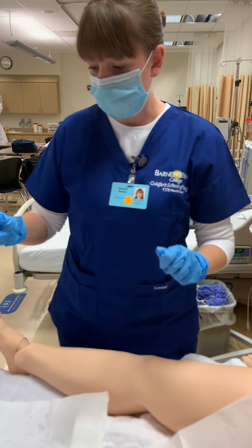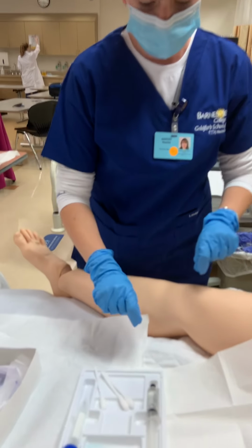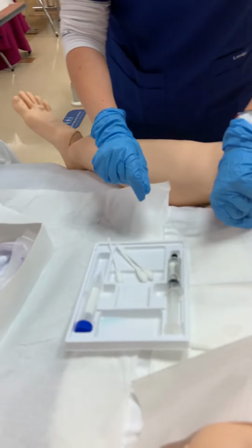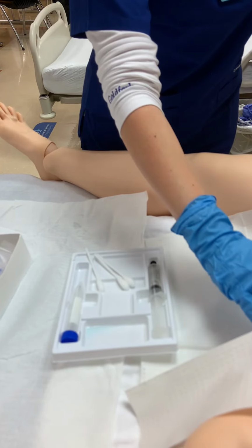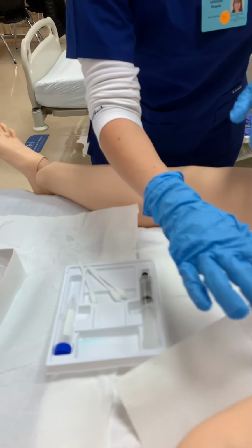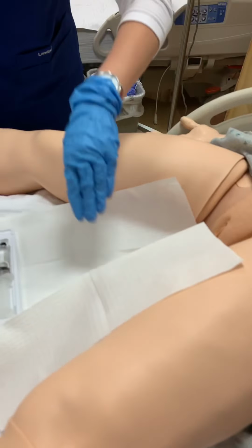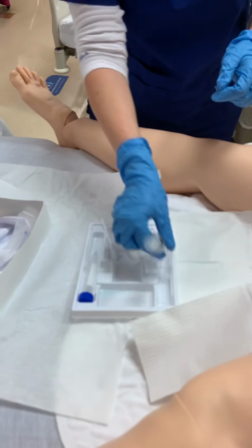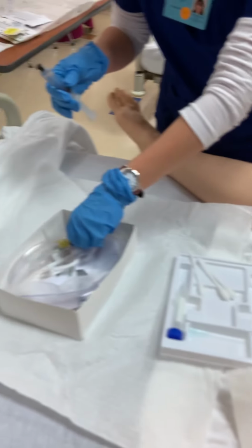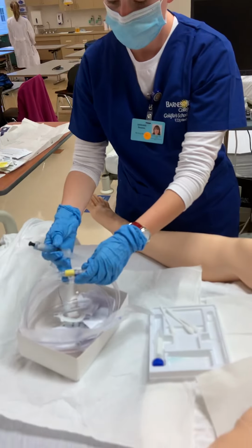Alright, so at this point I am going to take my syringe here. Now that I have my sterile gloves, I'm just going to push this down just a little bit. Okay, so I'm going to take this and connect that catheter piece here.